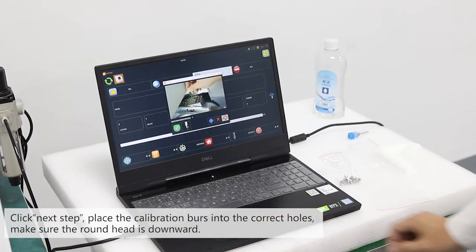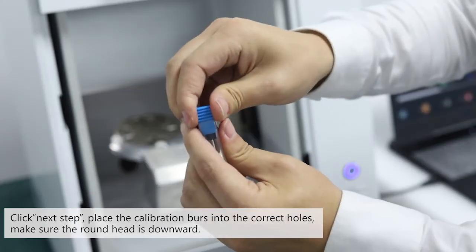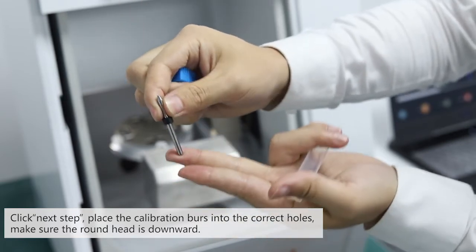Click next step. Place the calibration bars into the correct holes. Make sure the round head is downward.